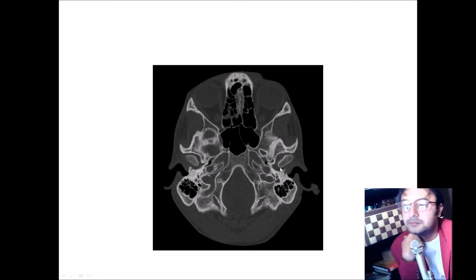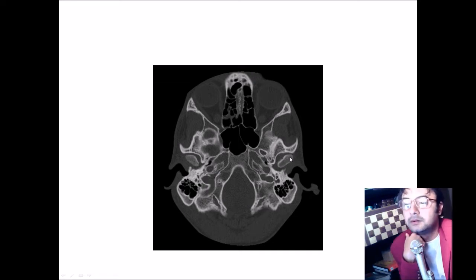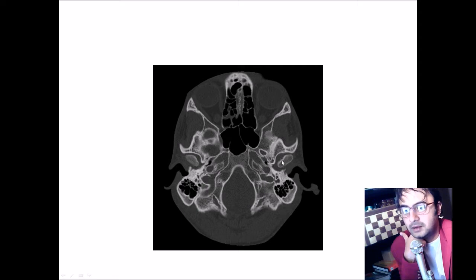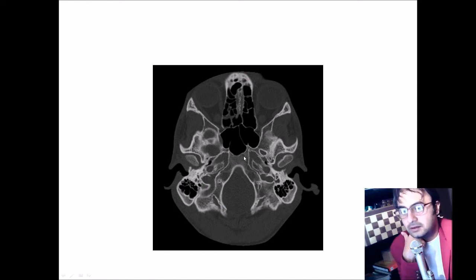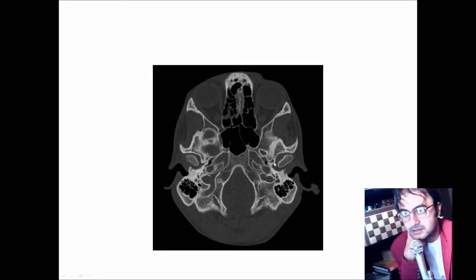This bony structure here is the condyle of the mandible, at the level of the glenoid fossa — these are the condyles bilaterally. This is the temporal bone, and this is the sphenozygomatic suture. The clivus is beautifully seen in this section, along with the bilateral mastoid air cells.